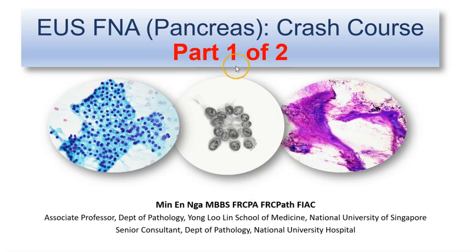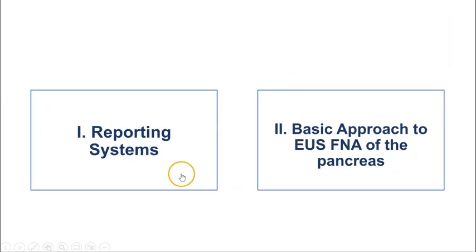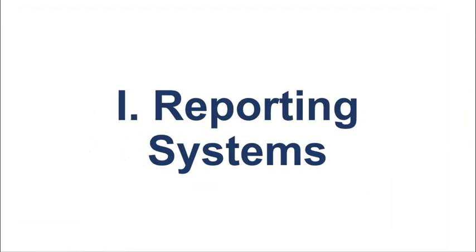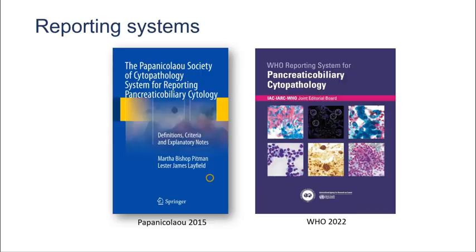Hello, this is the first of a two-part video series on a crash course on endoscopic ultrasound guided FNA, or EUS FNA, of the pancreas. We will first look at some of the major reporting systems that are in use for cytopathology of pancreatic lesions, and then we will look into the basic approach to EUS FNA of the pancreas. Let's start with reporting systems.